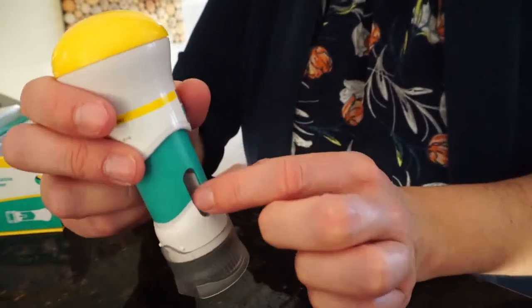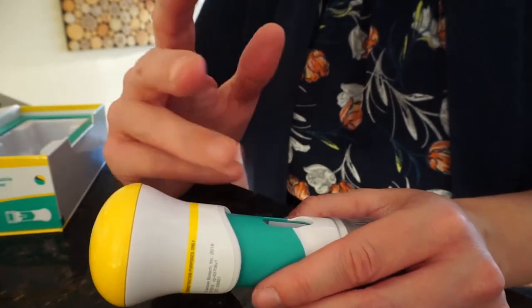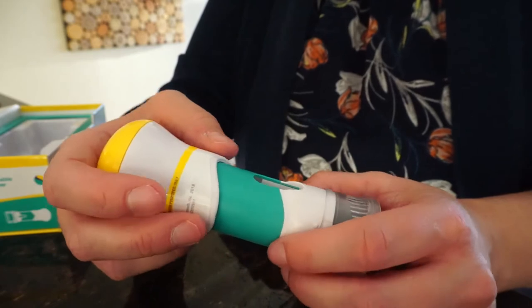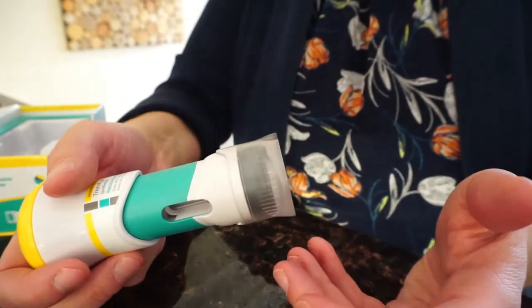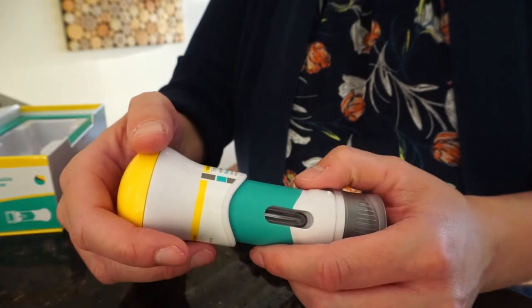The medication will be visible in the window on the pen. It should be clear-ish, but if it's cloudy or if you see particles, that's not normal. You should either contact your pharmacy to get a replacement or call your rheumatologist — they usually carry samples.